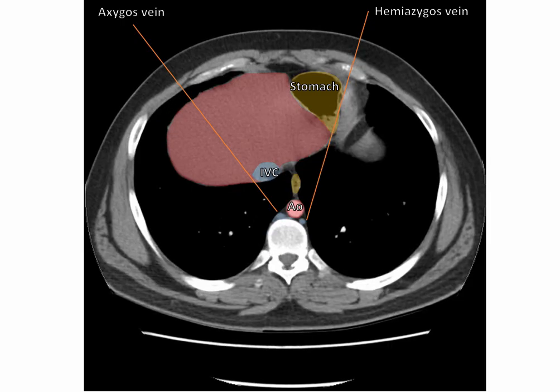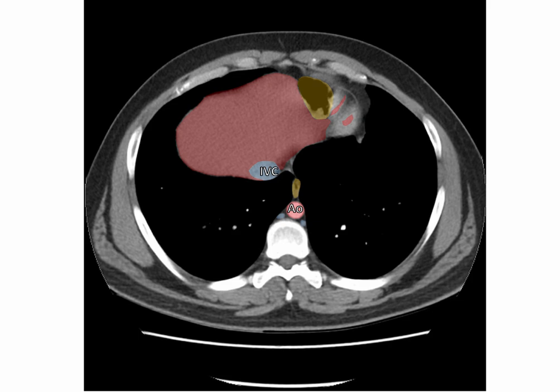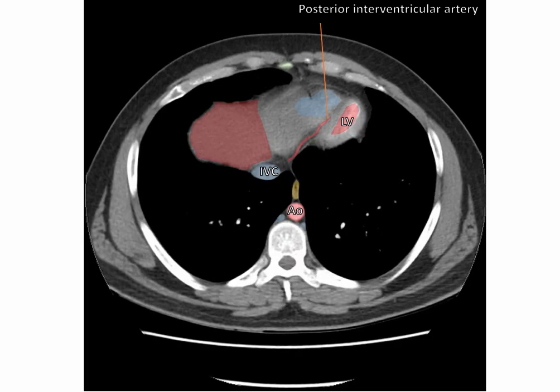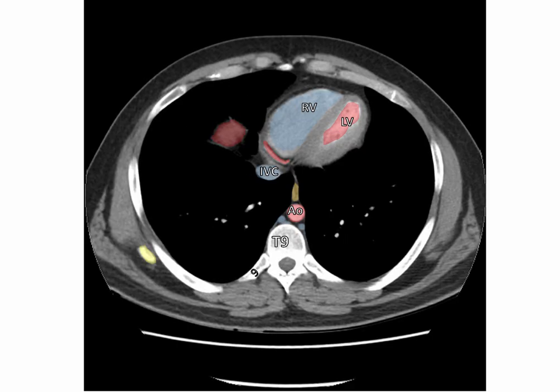We are now almost completely above the level of the diaphragm. We can begin to see parts of the pericardium and heart. Here is the left ventricle, and here are the posterior interventricular vessels. At this level, which we call the low cardiac level, we are beginning to see the right ventricle, which is separated from the left ventricle by the interventricular septum. We can follow the posterior interventricular artery more proximally to where it is becoming the right coronary artery. Also at this level, we can begin to see the inferior angle of the scapula.